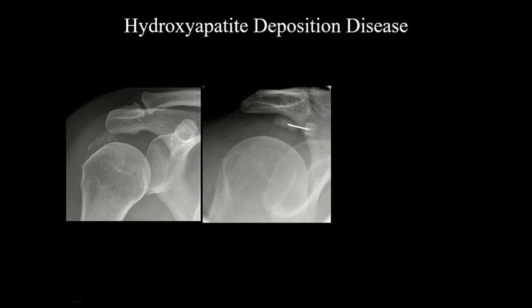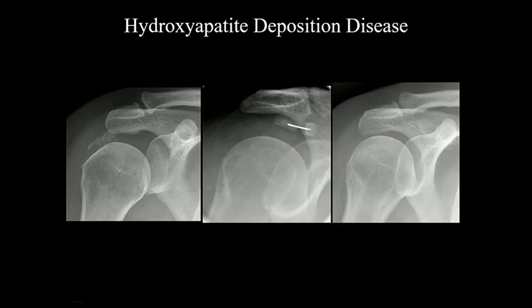If you do this, you can do it under fluoro or under ultrasound, and what you're going to do is try to break up the bulk of the calcium, pull it out with an aspiration, and it's usually pretty chalky looking, and then inject a lot of steroids if the patient can tolerate it, as well as lidocaine and ropivacaine on the way out. Afterwards, all patients will resorb in time, but this will be a prompter response.